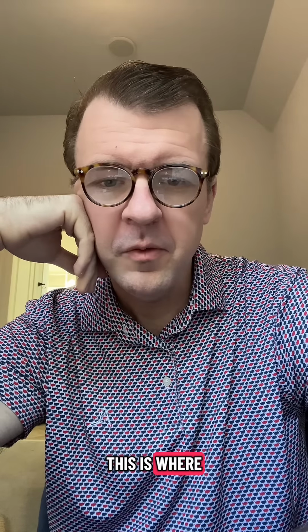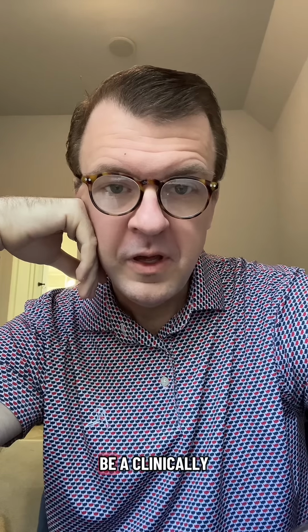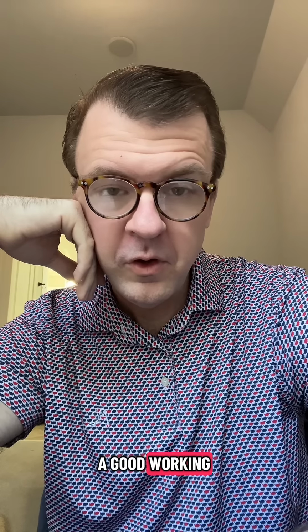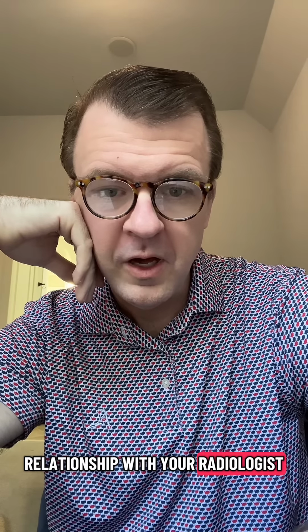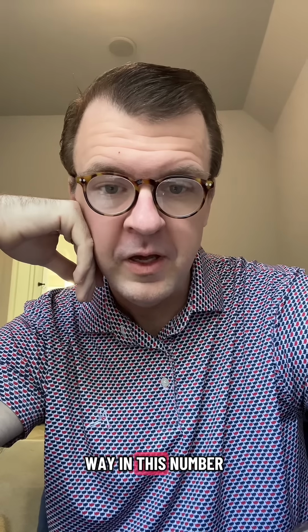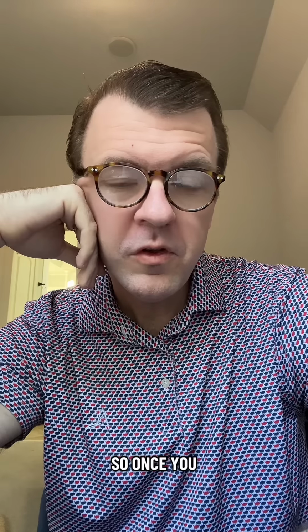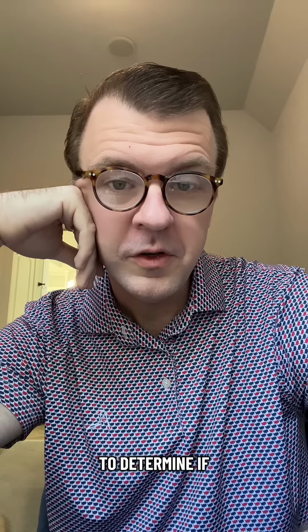A 3 is where it kind of becomes tricky, and this is where you really need to trust your radiologist. Usually a 3 is unlikely to be a clinically significant prostate cancer, and so if you have a good working relationship with your radiologist and really believe in a very definitive way in this number, it's actually probably reasonable not to biopsy these.